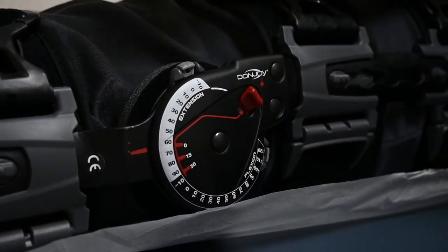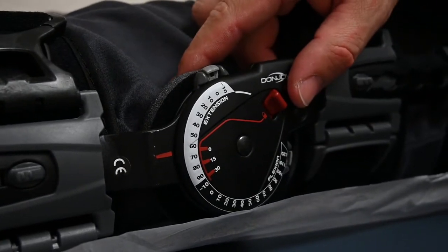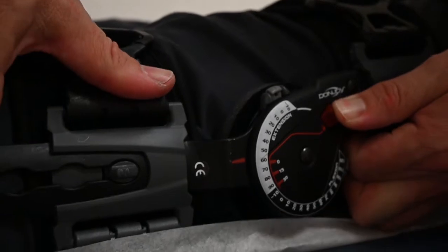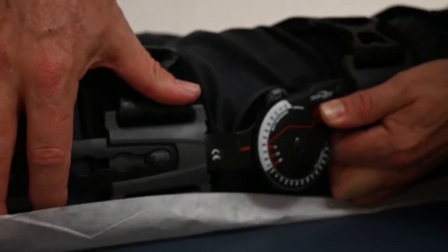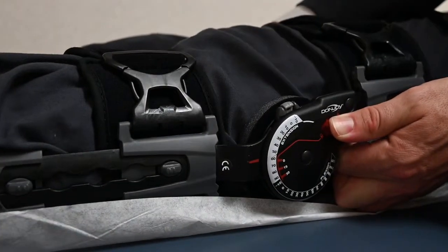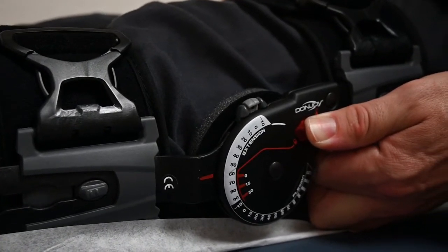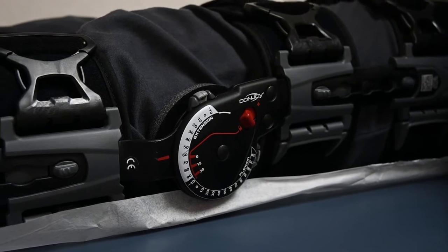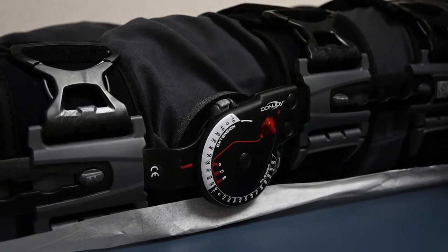Once we have applied the brace, we are going to lock the brace out straight. We want to push the knee into extension and then clip the brace into a locked position — and of course you want to do this on both sides. This will protect the knee from buckling during a period of significant quadriceps weakness after your surgery.